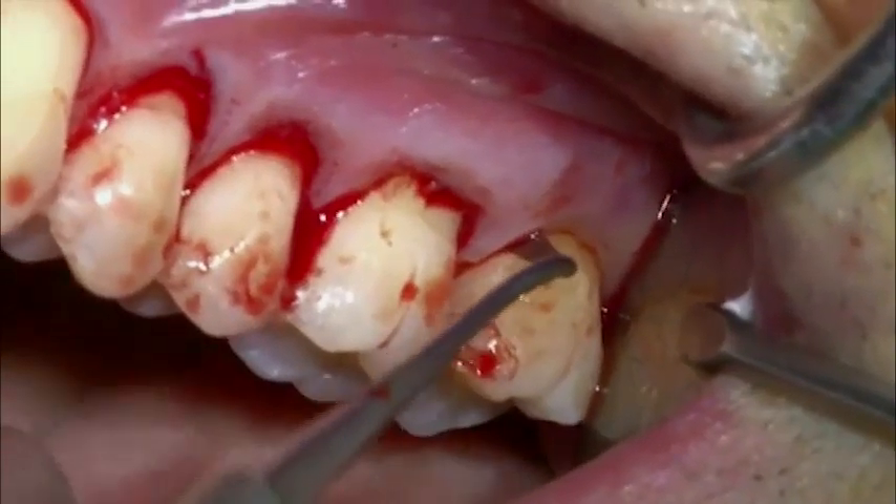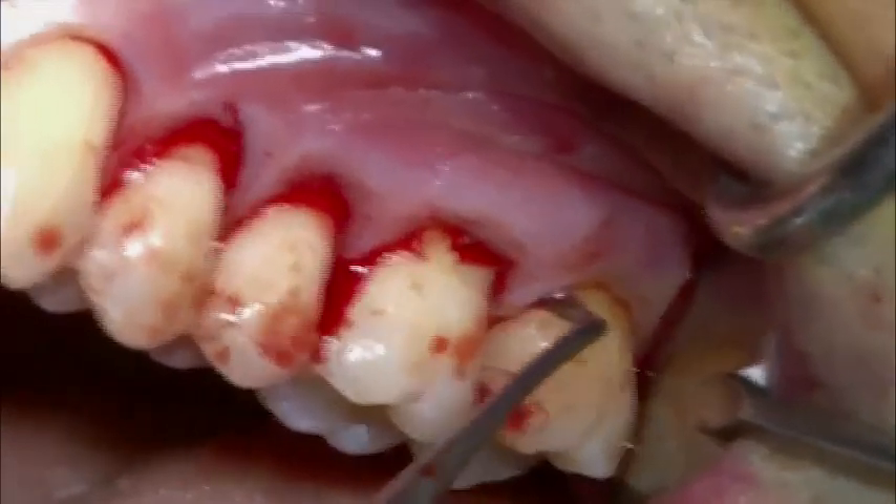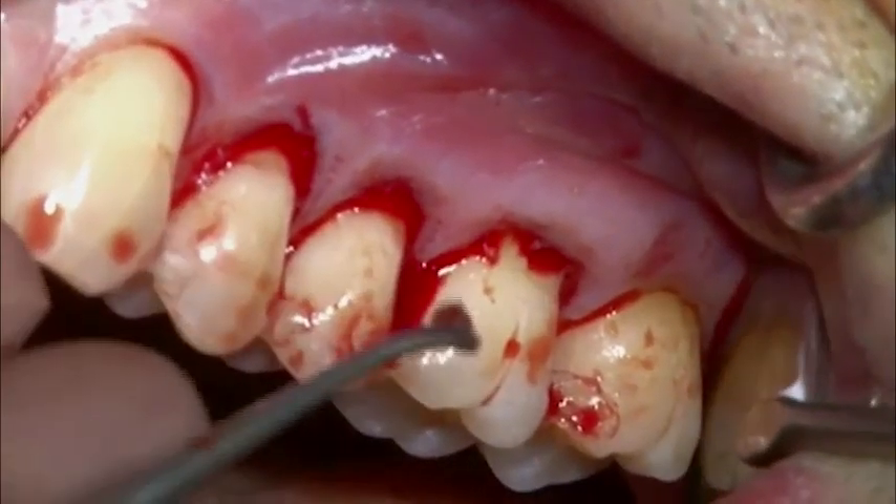After finishing the tunnel preparation, the papillae are elevated from the interdental bone with the papillae elevator.